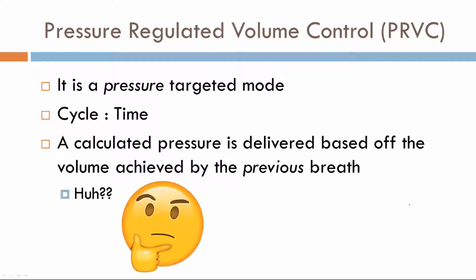breath. Now I'm sure some of you are a little bit confused by this, but not to worry, in the subsequent slides, I'll be showing images of PRVC and keep on coming back to this statement. So with time, the statement will hopefully make a little bit more sense.